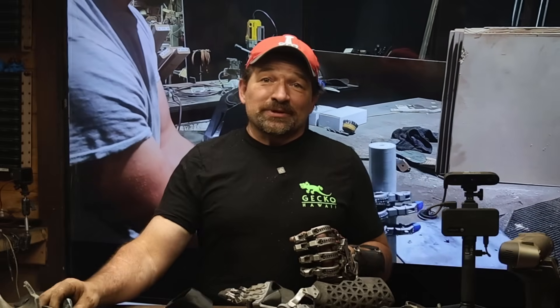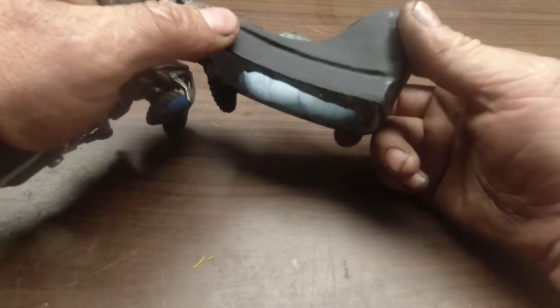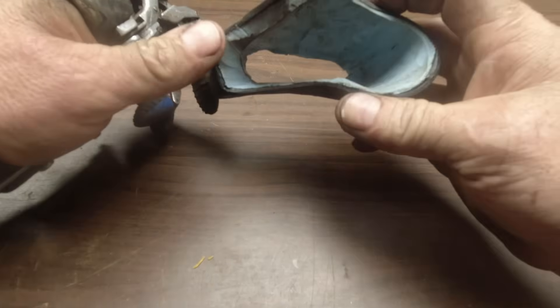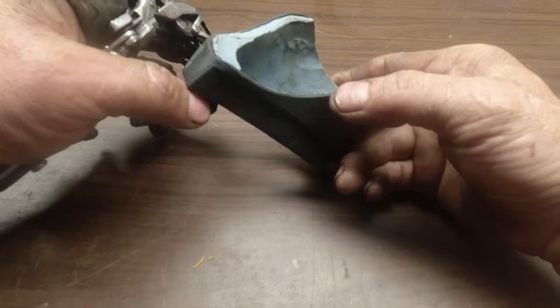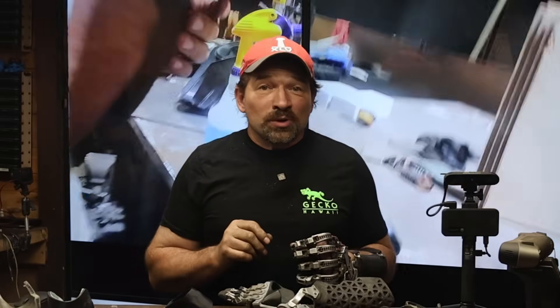With the socket off, I was able to check and see if there were any voids or low spots in the silicone. There was a tiny pocket on the back of his hand and what looked to be a low spot on his palm. I used some of the trimmings to fill in the void and had him carefully put the socket back on and wait for the rest of the curing process. After another 20 or 30 minutes, the silicone had firmed up pretty nicely and we were ready to do a first scan of his new socket.